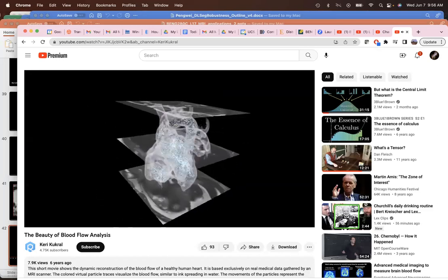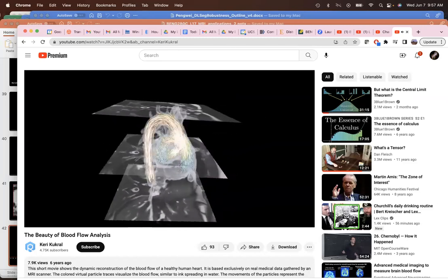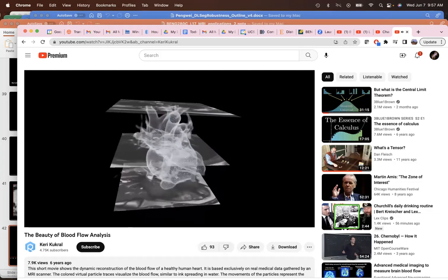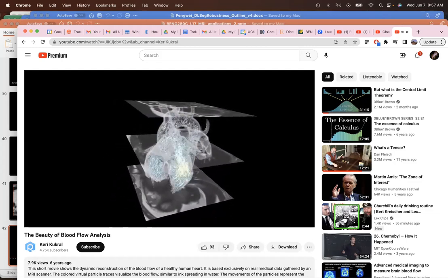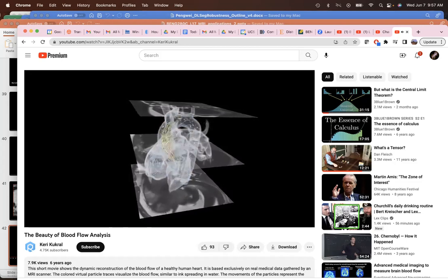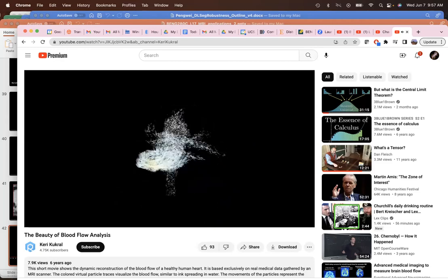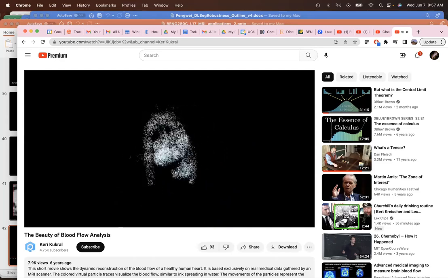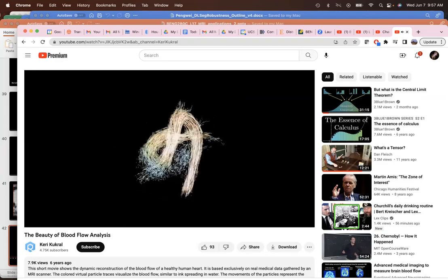It's a really eye-opening technology in that you can start to see, especially in people who have congenital abnormalities in their heart, very subtle differences in flow in different places, and then you can simulate the repair surgery, and ask questions like, would the flow be sufficient after this potential surgery?